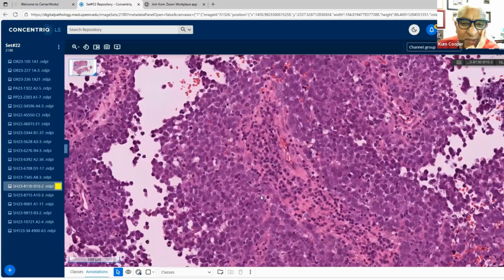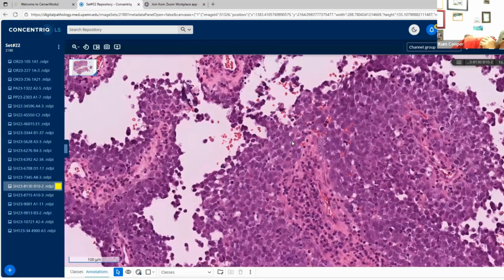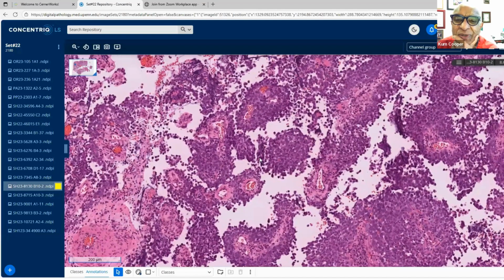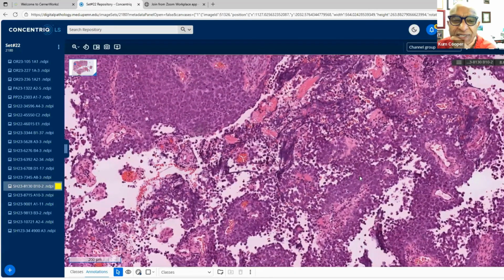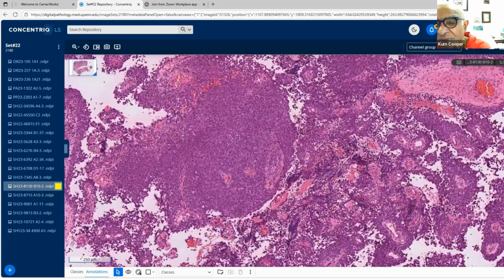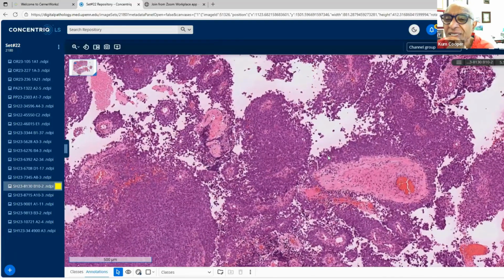Okay. So any thoughts you have? Skull-based tumor, 66 male. Looks pretty similar throughout. Here it's more a sheet of tumor cells, some thick wall vessels. And here you can see sinonasal mucosa, just to show you some normal looking sinonasal mucosa.